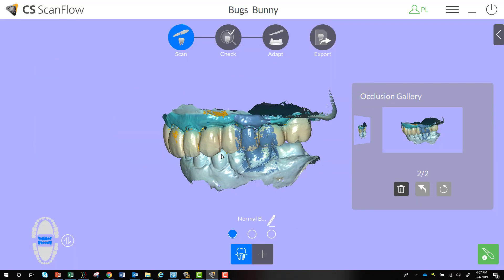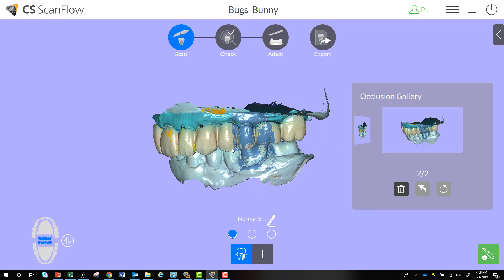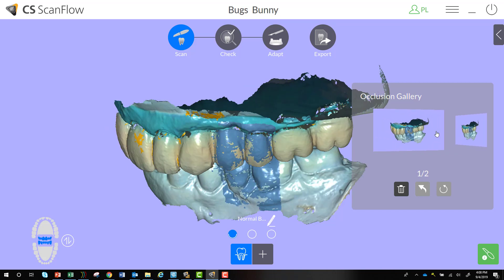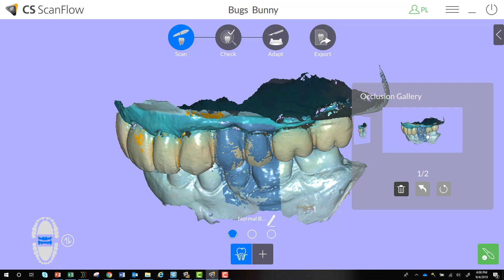Now we've captured our quadrant, and this looks a little different than what you're used to in versions 3 and 3.1. In those versions, you had multiple bite dots down below signifying each individual area where you captured your bite registration. Now those bite dots are not down below — each individual bite record is within the occlusion gallery. You can navigate through it, and if one is incorrect, just hit the garbage can to delete it instead of using the keyboard delete button.